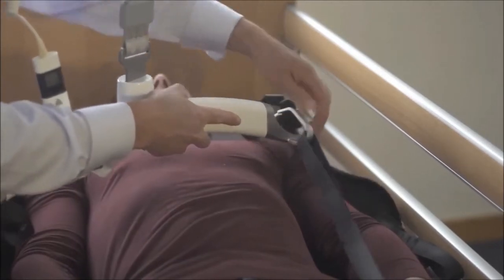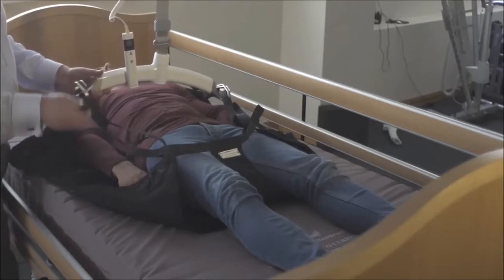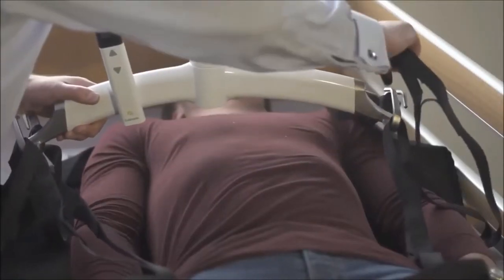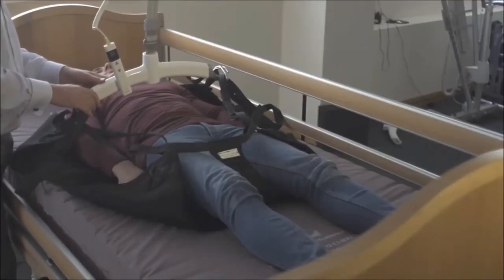And that loop there, and then we've got the middle strap — we're putting that one on the long one on this occasion. And we do exactly the same on the other side, the long section on that. And then we're ready for hoisting.